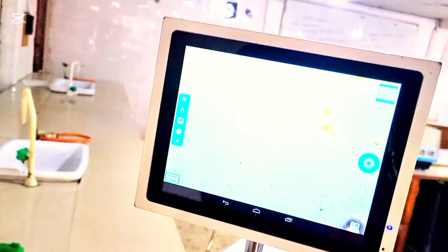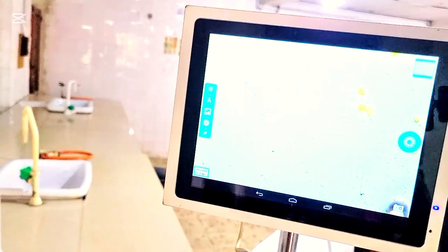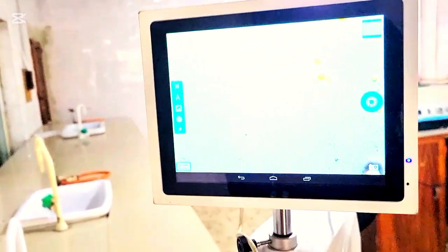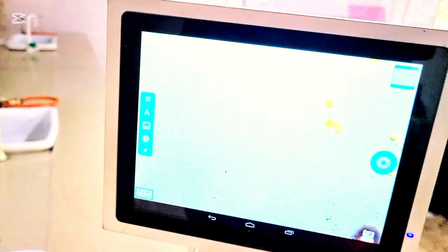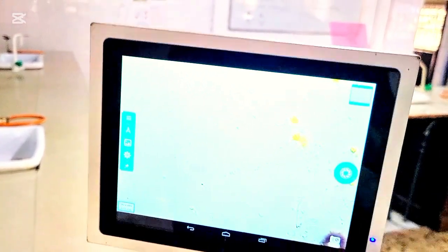If I take it now to the other side, you see that it's difficult for you to identify the cyst, but because of the iodine, the cell was able to take up the iodine preparation and come out this way. Unlike the direct wet mount, which I'm going to show you in a jiffy, you find that it's difficult to actually identify it, because this is a cyst, and iodine preparation helps us to identify cysts. So you see the beauty of making both preparations.